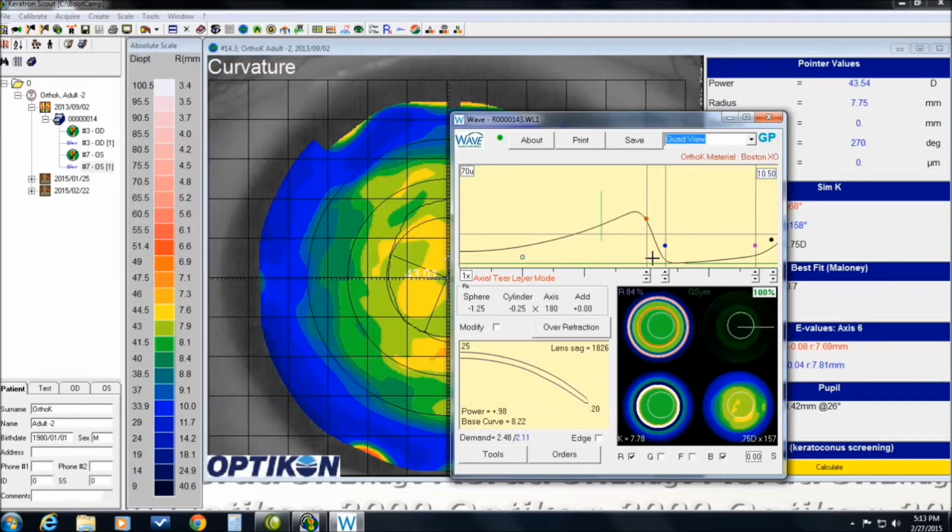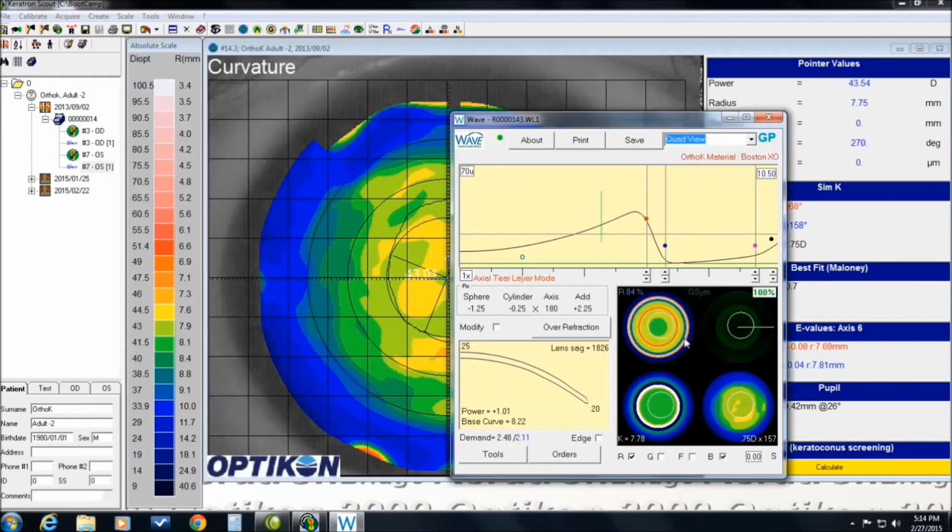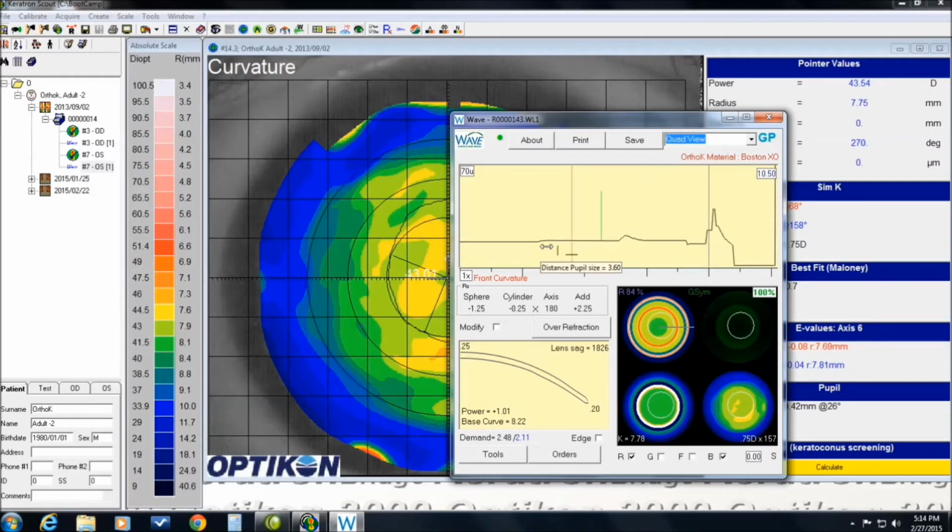By the way, she does place the lenses on before she goes to sleep at night, but she reads every evening, so I'll also add a multifocal to the front surface of the lens so that she can enjoy her bedtime reading. Maybe a 225 with a center distance, and I'll make that center distance small, about a 3 millimeter.